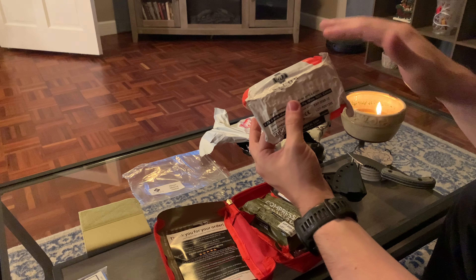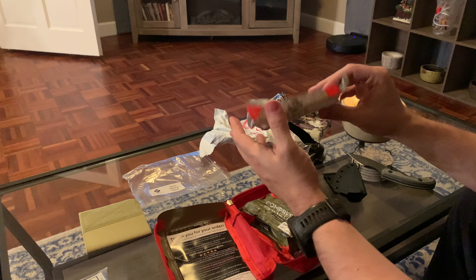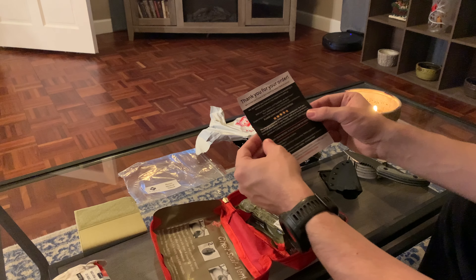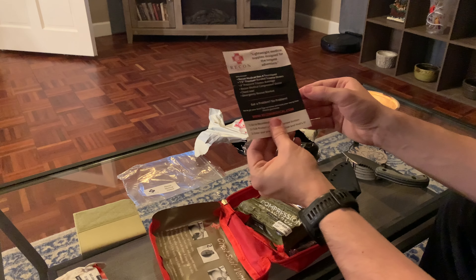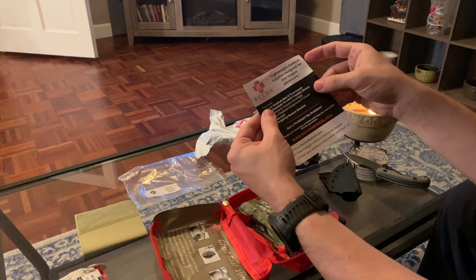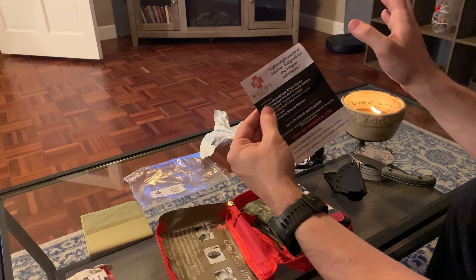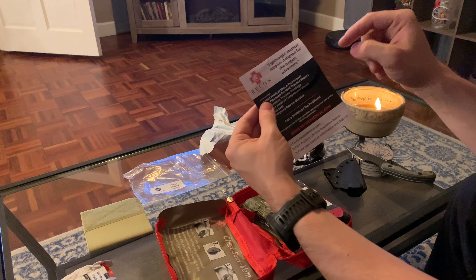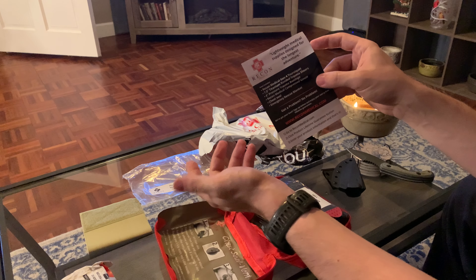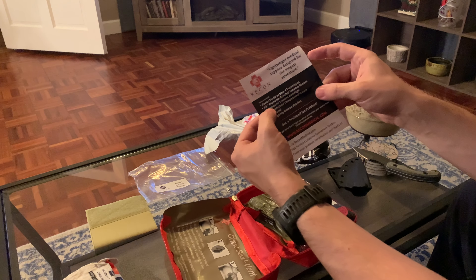We got a really nice four-by-four, four-and-a-half by four yards, six-ply white, 100% cotton — Z-fold gauze. This stuff is awesome. It's really compact and they vacuum seal it, so that's really helpful. You don't want it loose — once these get open, you lose the sterility of it. So for an emergency kit, you want it vacuum sealed so it stays sterile. Really appreciate you guys sending this out — me, my wife, and our dogs and cats.